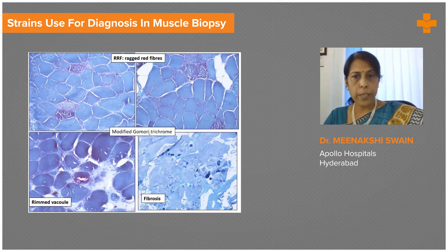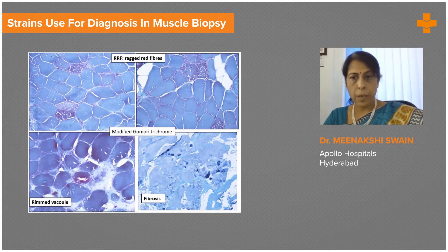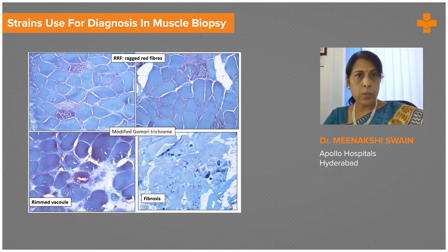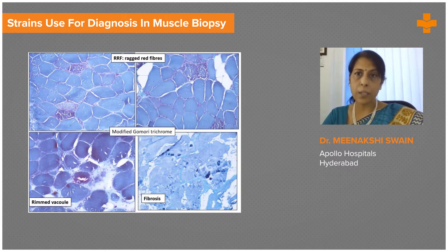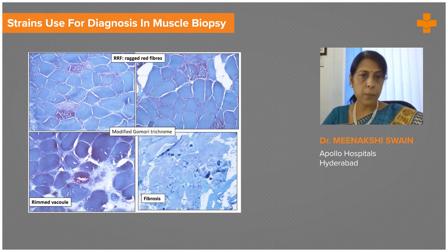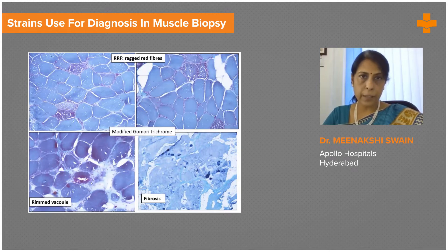The modified Gomory trichrome, as mentioned, shows up fibrosis. It stains muscle green, and fibrous tissue also green, albeit a slightly paler green. More importantly, it shows up red ragged fibers — ragged as seen in the image — with a red rim to them. These are mitochondrial aggregates, and this is a feature seen in mitochondrial myopathy. Rimmed vacuoles, seen in certain inflammatory myopathies, also have a red rim on Gomory trichrome. So this is a good histochemical stain which aids diagnosis.